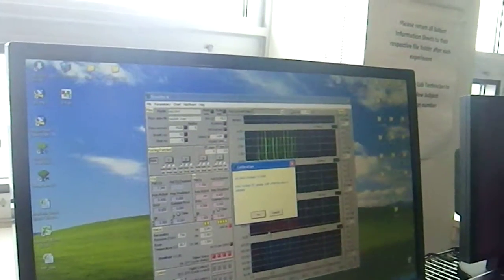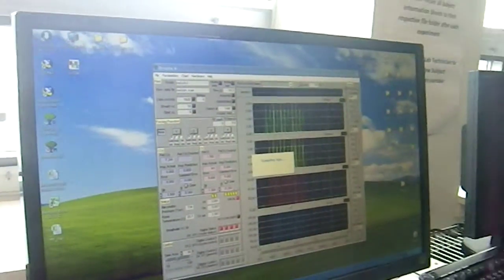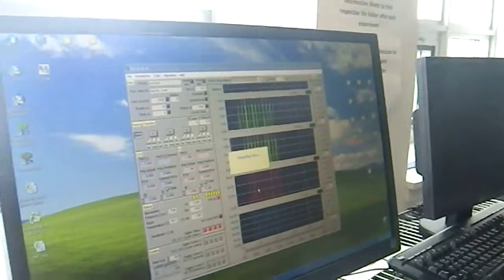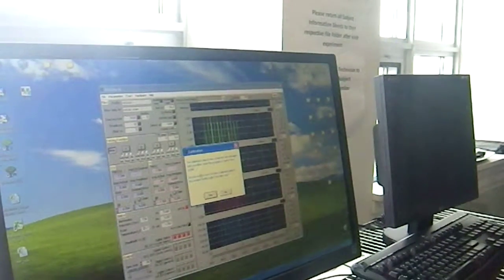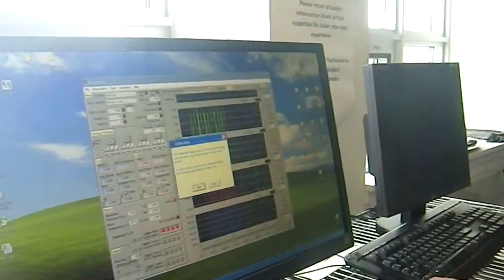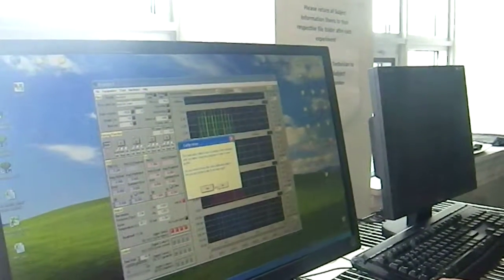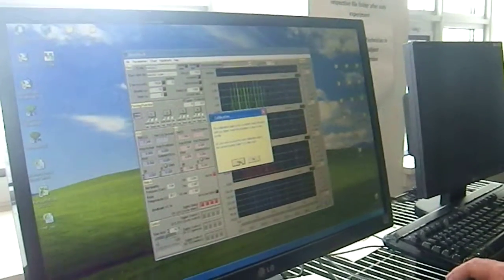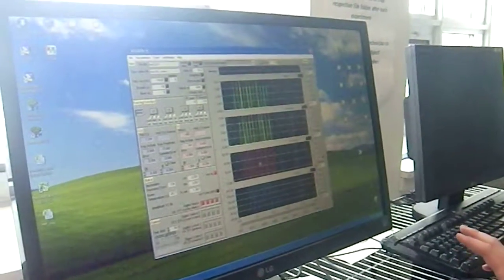This is just pulse oximeter. You can just hit OK on these. And then we'll do it again. OK. So this now is asking if you want to save it as the file name you picked. I usually hit yes in case you do other testing for the day or within a few hours, and then you don't have to redo the calibration each time. So now calibration 1 is done.